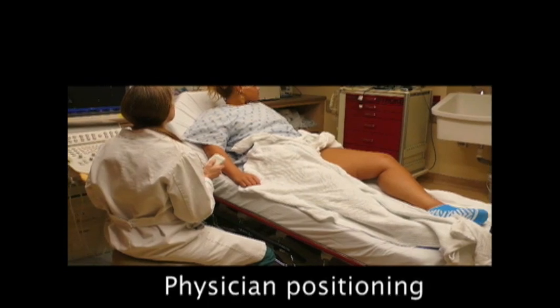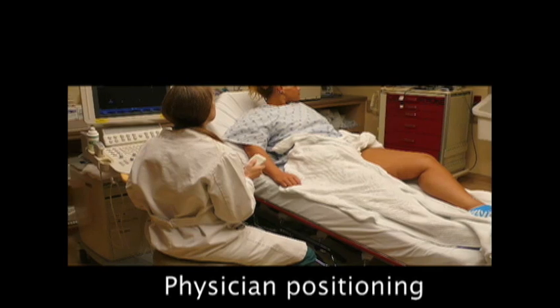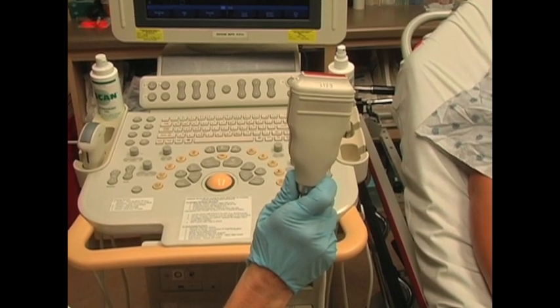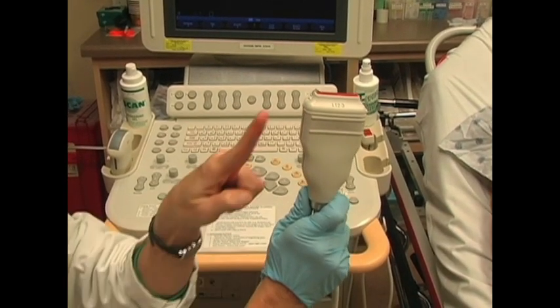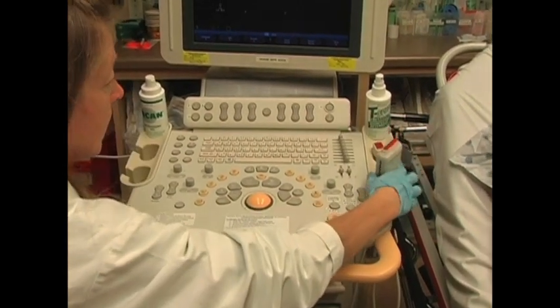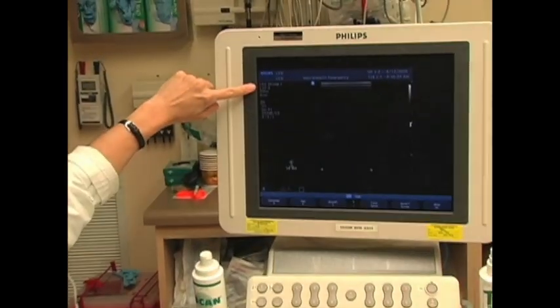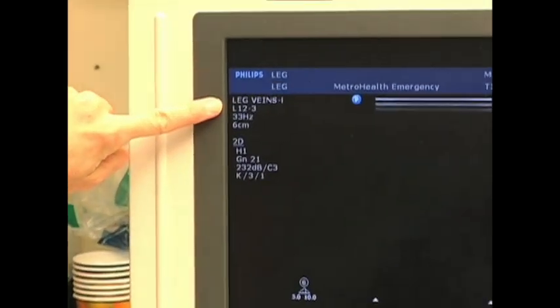Following standard emergency ultrasound conventions, the ultrasound machine should be placed to the right side of the patient, and the physician should be comfortably seated with easy access to the machine and the patient. A linear high-frequency ultrasound probe should be used to achieve the greatest resolution. The indicator should face the patient's right side. On rare occasions, a curvilinear probe may need to be used in patients with large body habitus and deep-lying vessels. The ultrasound software should be configured to the manufacturer's vascular settings to yield optimal images.